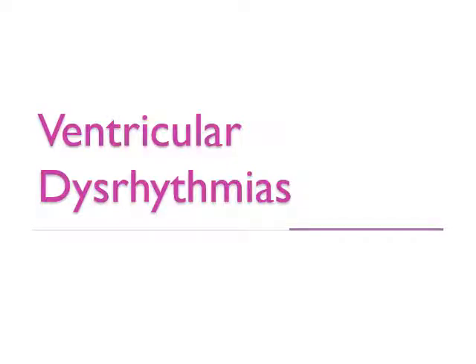So when we talk about ventricular dysrhythmias, the problem manifested in the ECG would usually be in the QRS complex, if not the T wave, because your QRS represents ventricular depolarization and your T wave represents ventricular repolarization. We will be discussing three rhythms under this category. So we have your PVC, your VTAC, and then your VFib.